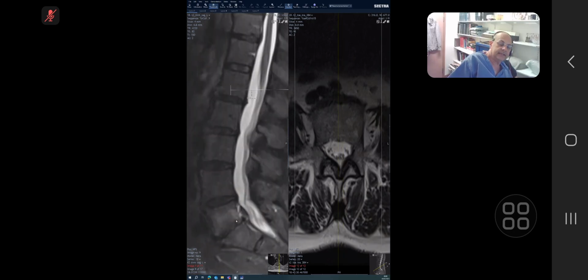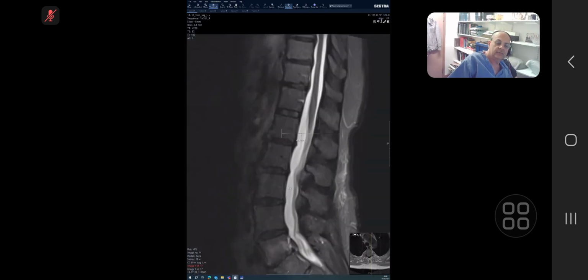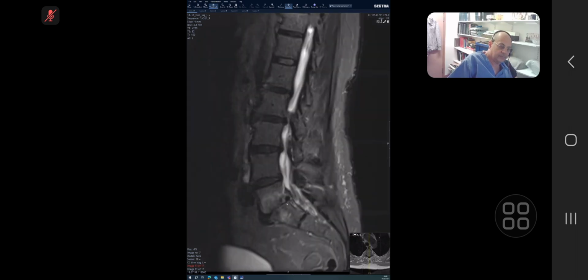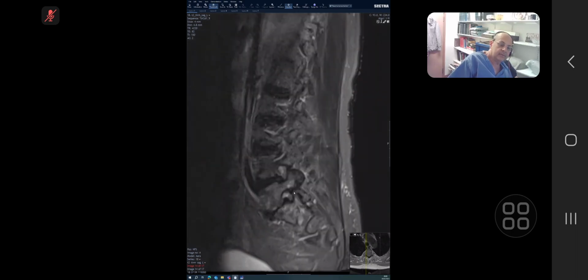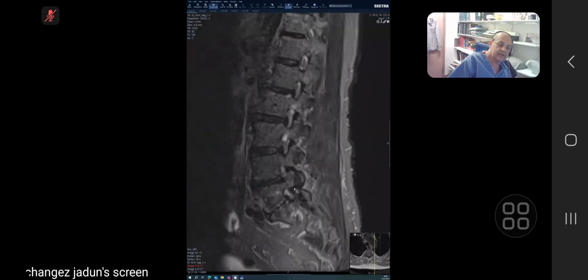The other important thing is L5-S1. You look at L5-S1, you have got a degenerative STIR hyperintense signal, disc space reduction, Modic 1 endplate degenerative change. Here you suspect that there is a pars defect with exit foraminal compromise, and you can see there is sclerosis here.